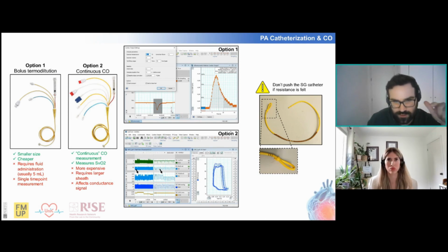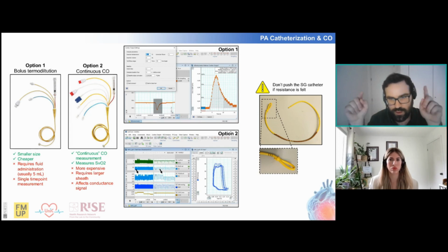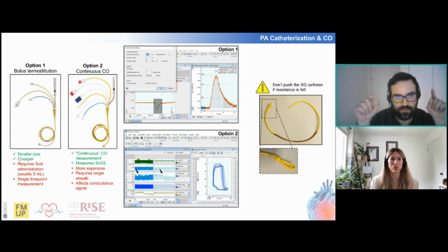Also, when we first started thinking about doing biventricular PV loops, we were very afraid of interference between the two ventricles, because we do see this in small animals. And we did know of another research group in Denmark that were applying a filter to the volume signal that would remove this interference.